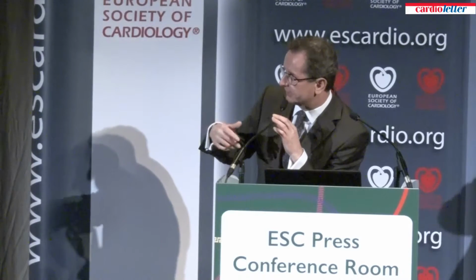good news for the patient, we can treat this very effectively using drug-eluting balloon post-dilatation. So the majority of the patients with the need for side branch stenting, if they had significant stenosis of more than 75% or they had a positive FFR measurement, we performed drug-eluting balloon dilatation, and this was working very nicely.